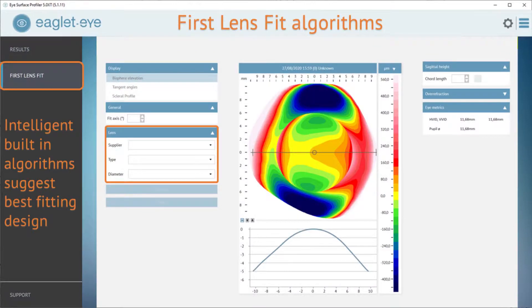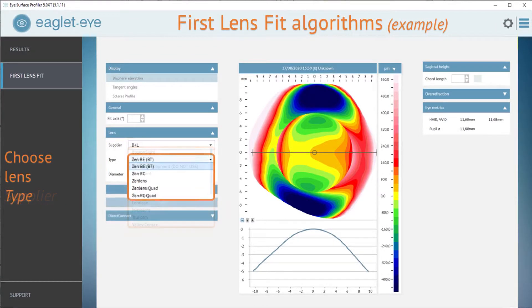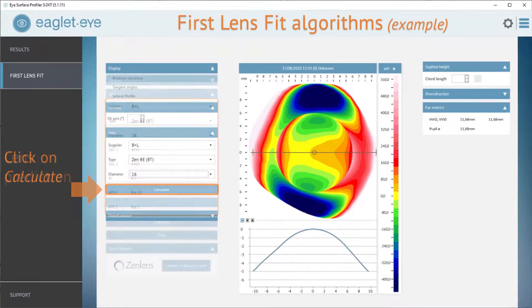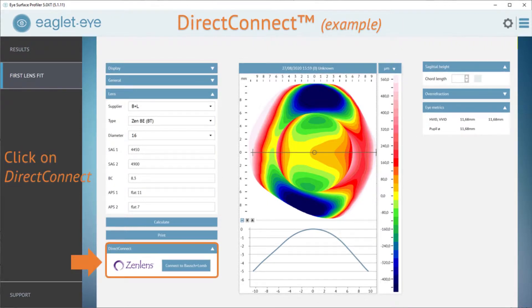The real core of the Eaglet Eye lies in the first-fit algorithms. We select the lens of choice — in this case, the Zen lens from Bausch and Lomb. From the HVID, we've selected a 16-millimeter overall diameter, and we just click calculate. From the accurate measurements from the ESP, the algorithm gives us what it considers the ideal lens, with two different sagittal heights, an optimal base curve, and even suggestions on the advanced peripheral system or landing zone.